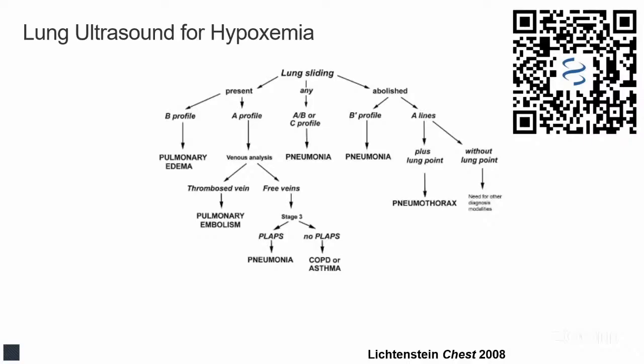I do want to put a little caveat here. Please don't do that. Please always use the clinical information that you have available to you, physical exam and history, labs, when you're trying to figure out the cause of respiratory failure in your patient. But I'll highlight the way that this was used.